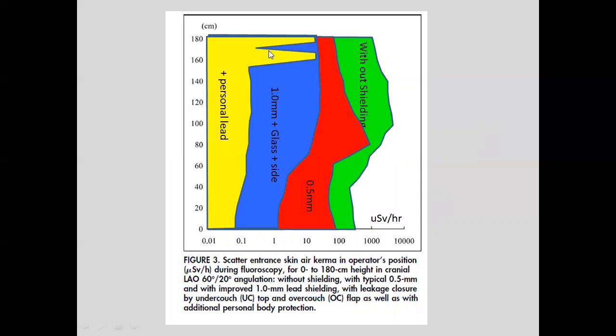That's the head, and he's wearing leaded glasses. So to prevent cataracts, which is one of the late effects that can happen, wear lead glasses. But this also brings up, look how much radiation the cranium is getting. So what are the risks?